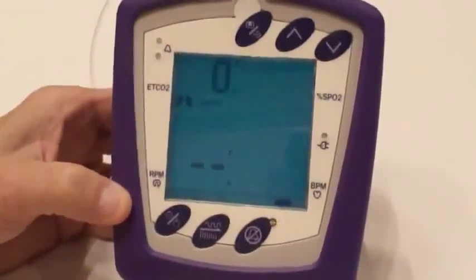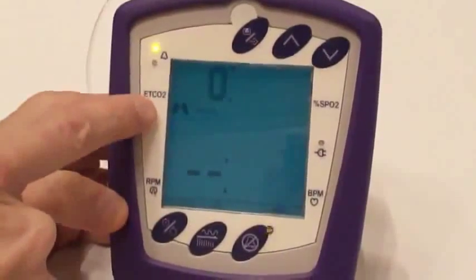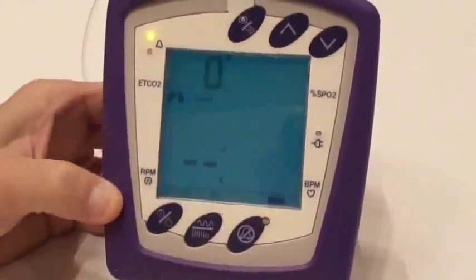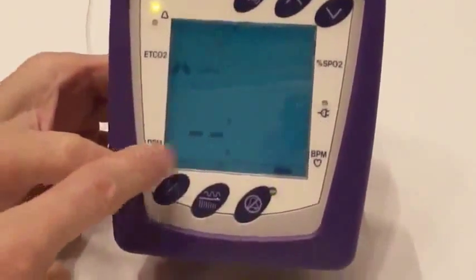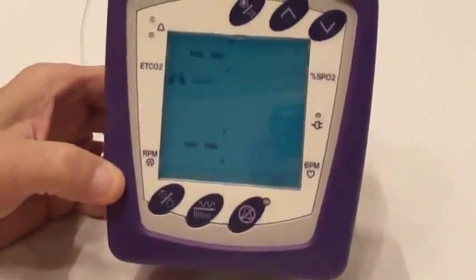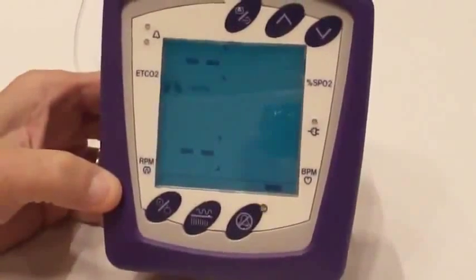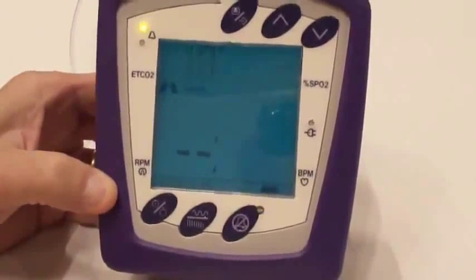As you can see there up top here you have where you're going to be monitoring your End-tidal CO2 through the nasal cannula. Then down here will be your respirations per minute. Should start getting a reading here pretty quickly. There we go.